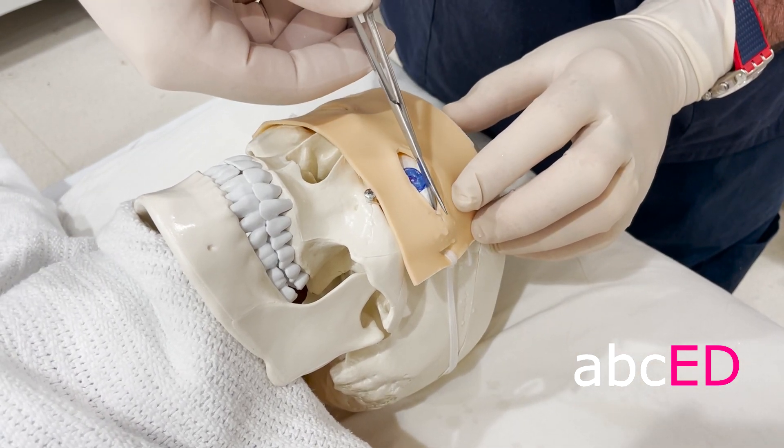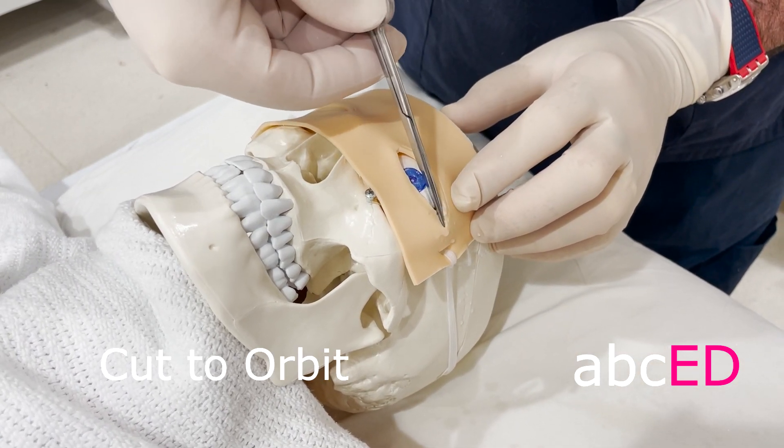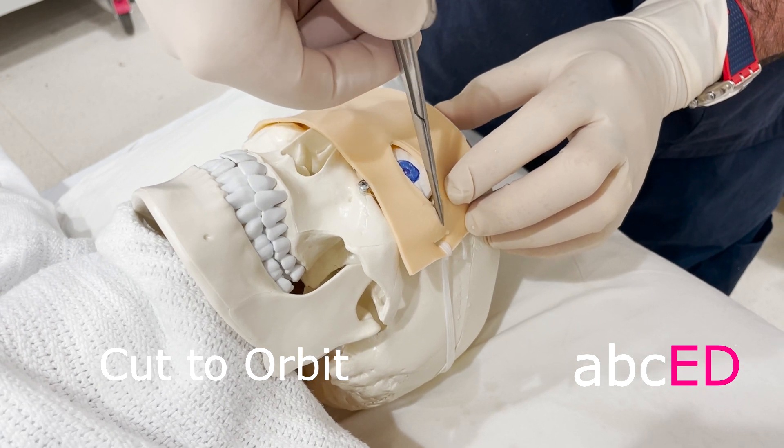Get your small scissors again, going away from the globe, and we're going to make a cut all the way to the edge of the orbit.